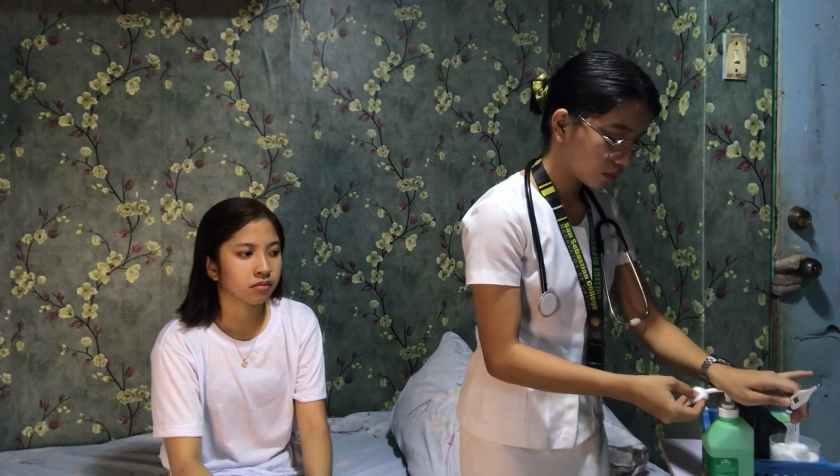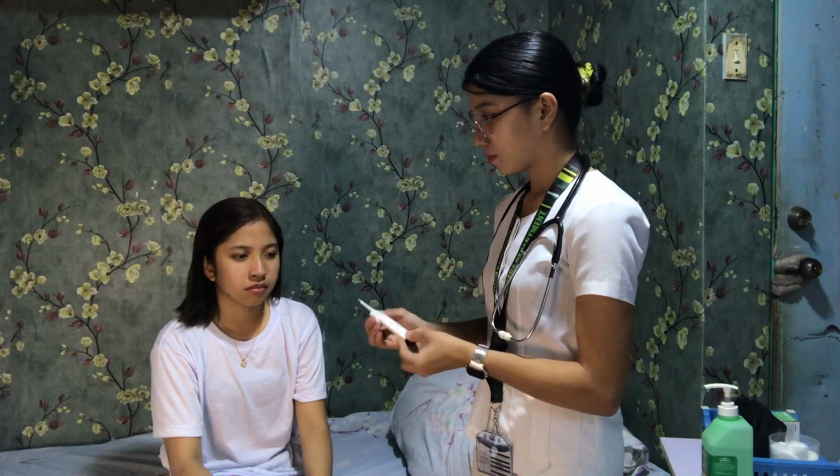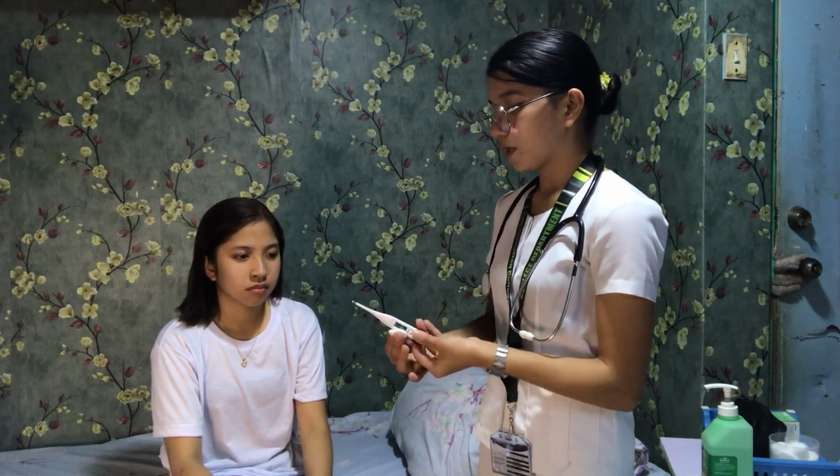Before placing the thermometer back, we need to disinfect it again. We're going to disinfect the digital thermometer from stem to bulb. It is important to disinfect the thermometer to avoid contamination.